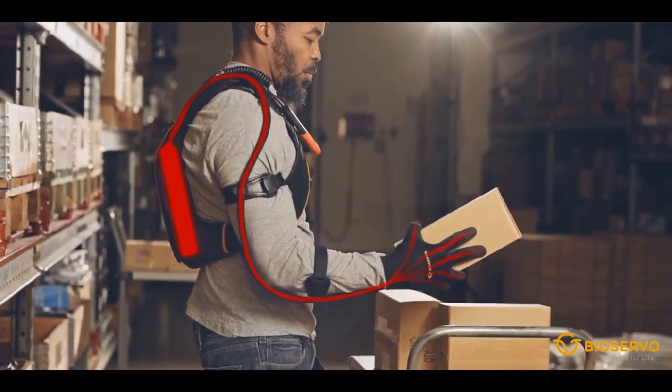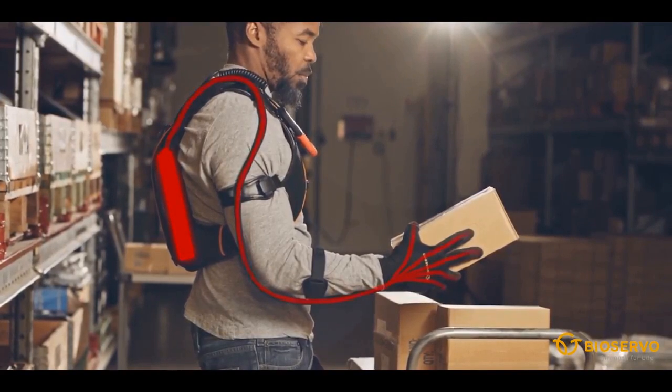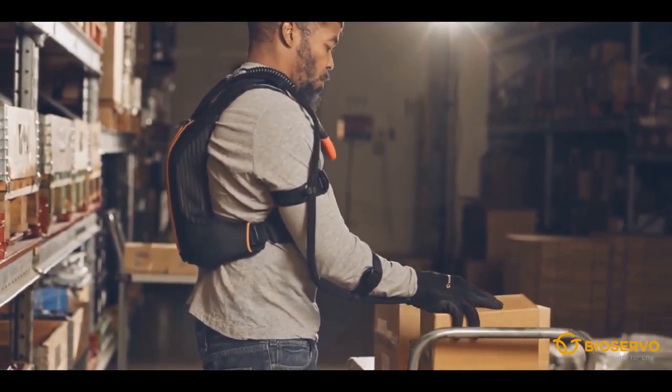The sensors in the glove give input to a sophisticated control system that activates artificial tendons in the fingers and performs a natural grasping motion.